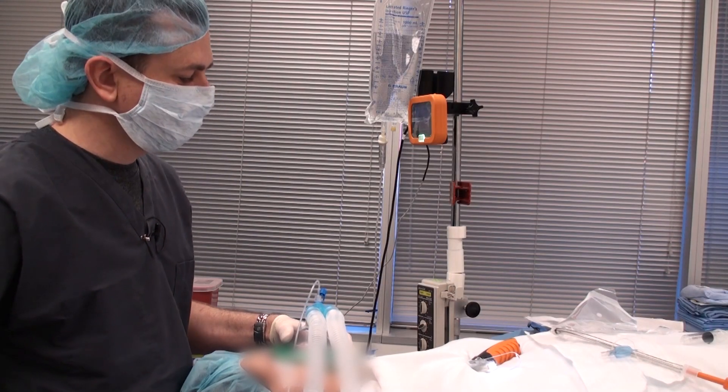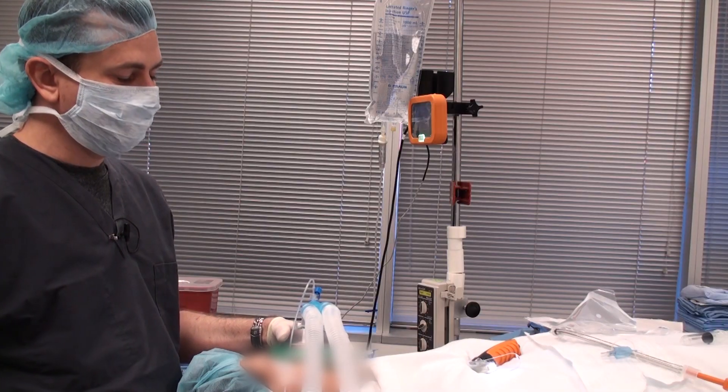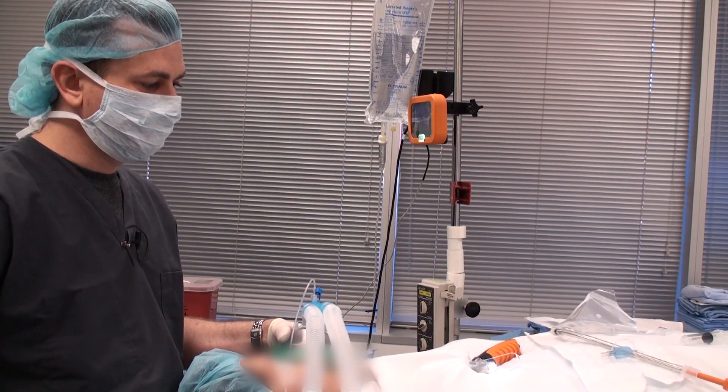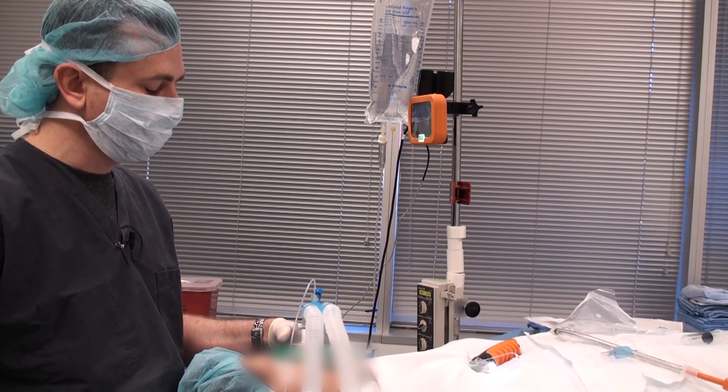One of the most common complaints clinicians have when using any video laryngoscope is that they have a perfect view of the vocal cords, but it can be difficult to deliver the endotracheal tube through the cords. So today what we're going to talk about is proper technique.